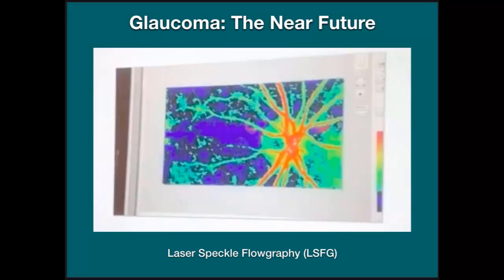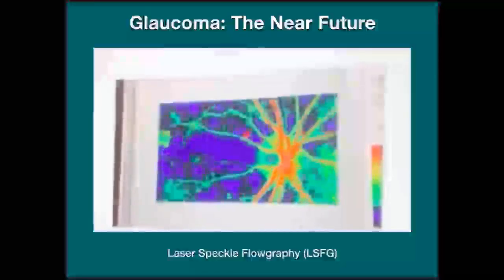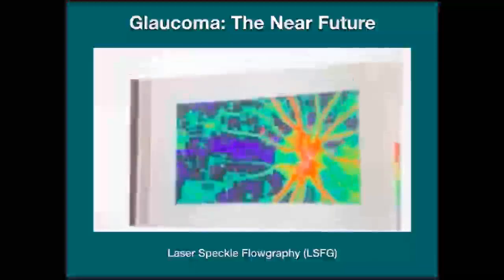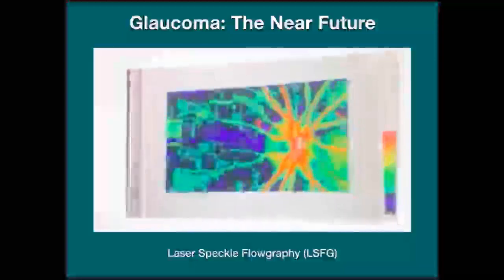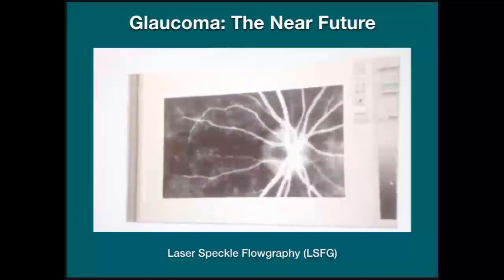I find that amazing. In fact, it bears repeating that image. We're so used to seeing static views of the eye, we don't realize it's such a dynamic tissue, and with each heartbeat, how much blood is entering the eye through the arteries and veins.